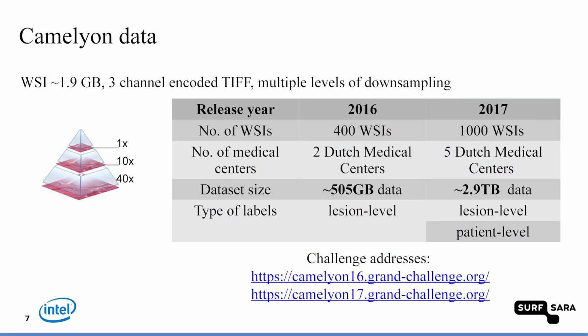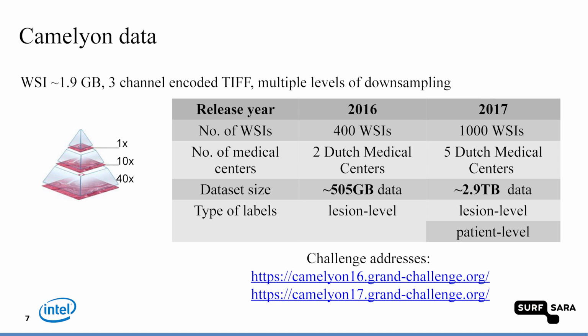And treat a larger patch. Of course, ideally, you would want to do the whole thing end-to-end, 40x. It's not feasible, of course. Our goal now, we didn't reach this goal yet, is to do 1x end-to-end. It still involves an image that is, I believe, like 20,000 by 30,000 pixels, so it's still huge. We are not there yet. But we managed to increase the patch level, as you will see in this talk, and I think get some nice results.